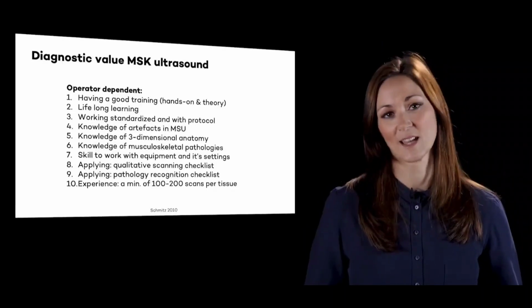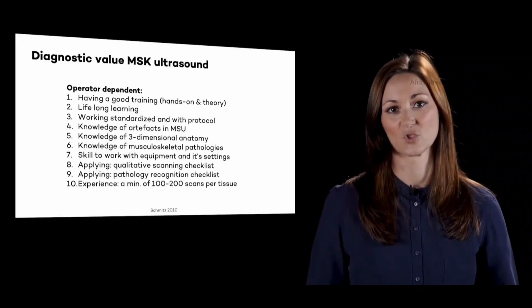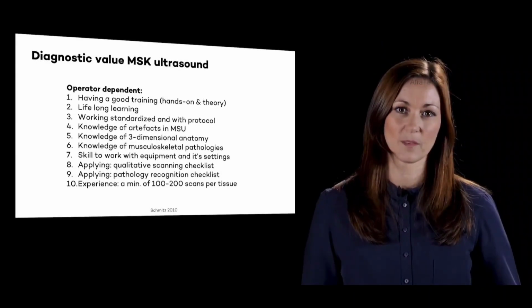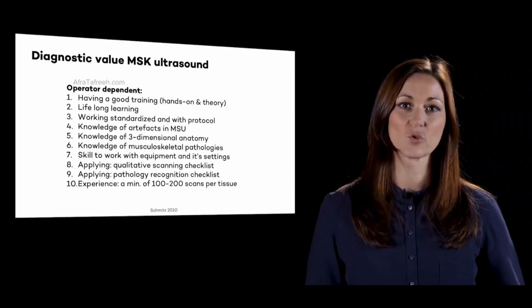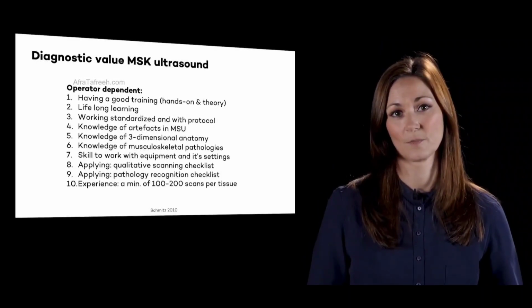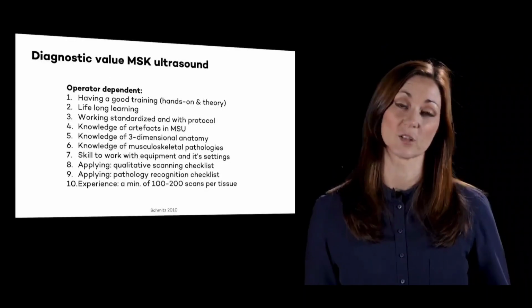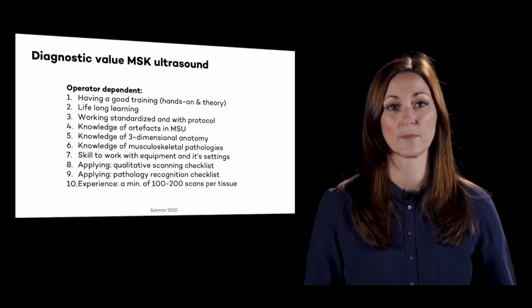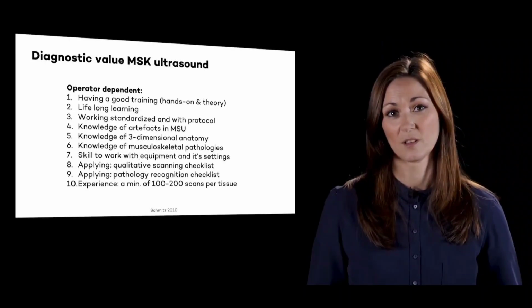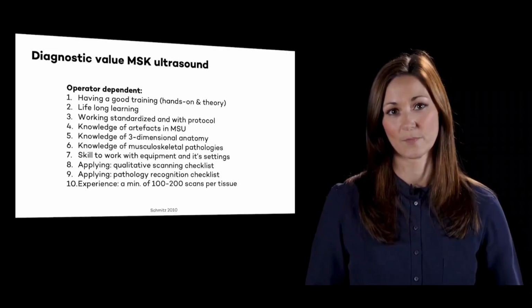Sonographers need to work in a standardised way, using existing protocols as a base to start scanning a certain joint. You will learn these protocols in the course. Using the protocols makes sure that you scan the absolute basics that are needed for a proper ultrasound assessment. In the next course levels, you will learn extra skills to become a more experienced sonographer. Knowing about artefacts is important. You will learn about these artefacts and their importance in another presentation.